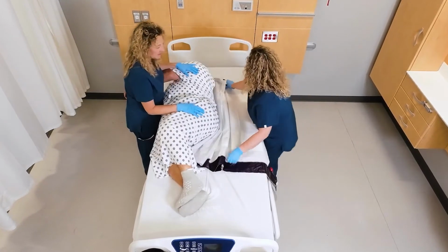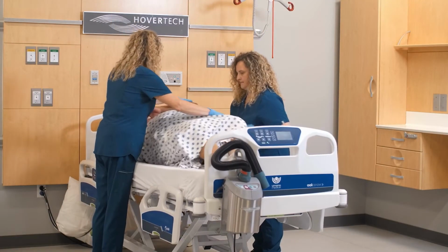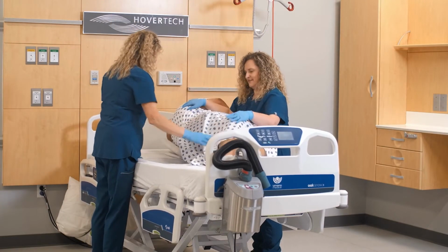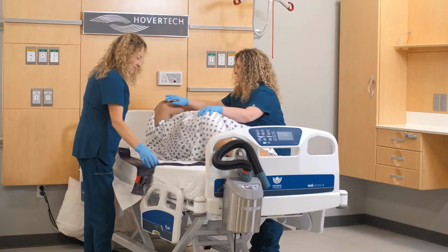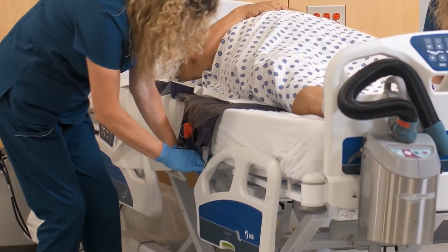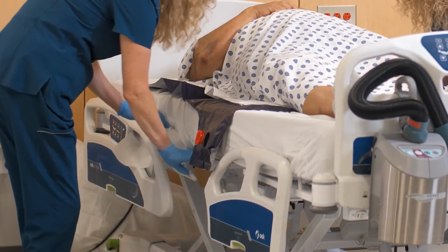Tuck as much of the Q2Roller and apron under the patient as possible. Lay the patient in a supine position and then roll onto their opposite side. Untuck the other side. Lay the patient supine. Tuck the apron under the mattress to secure the Q2Roller. Straighten the half-size hover cover.